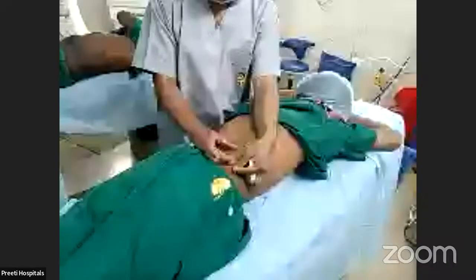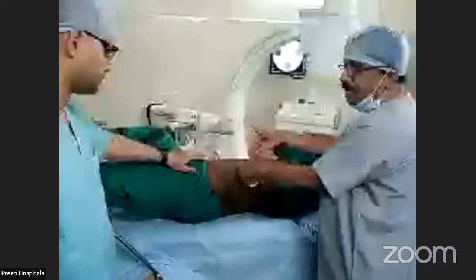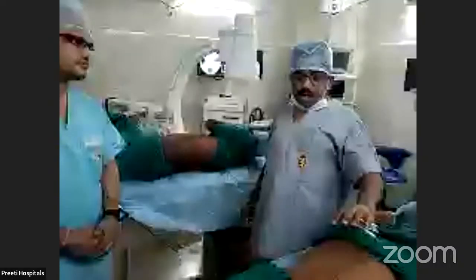And the other one is the spine. The stone will not come onto the spine in supine, unlike prone, because it is horizontal, the medial end will never come onto the spine. Whereas here, sometimes it will be opposite to the spine also. Even though it is coming onto this kidney, it may look beyond the spine.